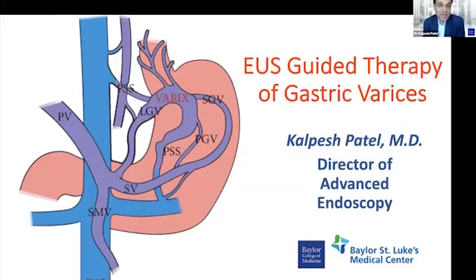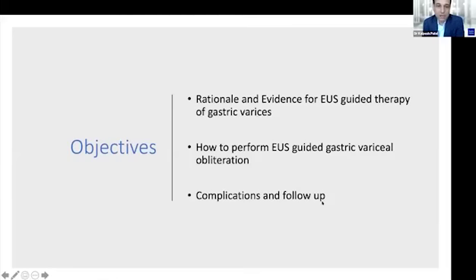I am going to discuss an area that I've become very interested in, which is the application of endoscopic ultrasound to the management of gastric varices. I'll present the rationale, followed by the current evidence for EUS-guided therapy of gastric varices, and then show in some detail how I perform this. Finally, we'll talk about complications and follow-up of these patients and the technique as a whole.